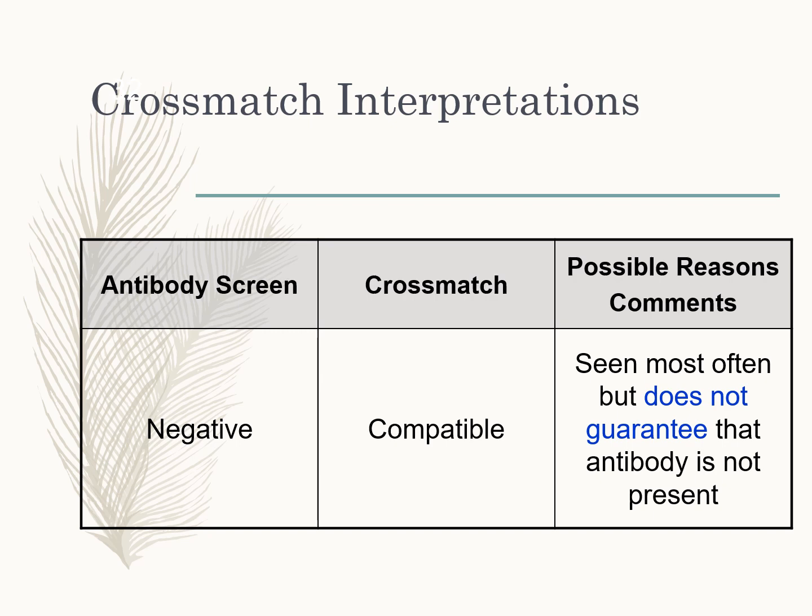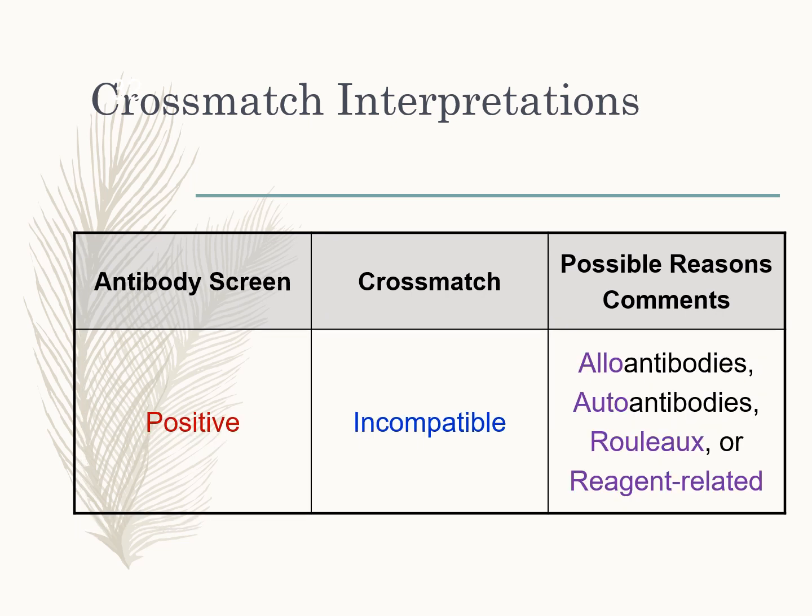So we'll go through some crossmatch possibilities. If your antibody screen is negative and your crossmatch is compatible, usually that unit is compatible, but it does not necessarily guarantee that an antibody is not present. There are low-frequency antigens that none of the screen cells have present. So a patient could make an antibody to a low-frequency antigen, and it shouldn't cause any problems if the crossmatch is compatible.